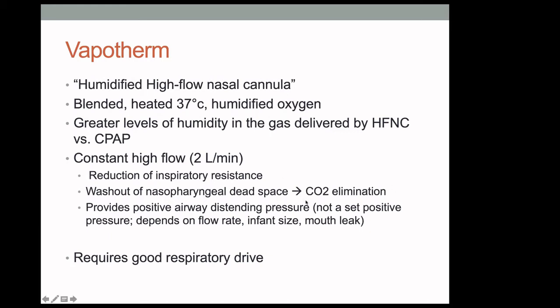And it also helps to reduce inspiratory resistance by providing a positive airway distending pressure. However, like CPAP, it does require a good respiratory drive, and you need to be breathing spontaneously in order for it to work.